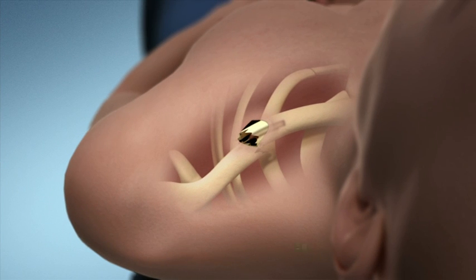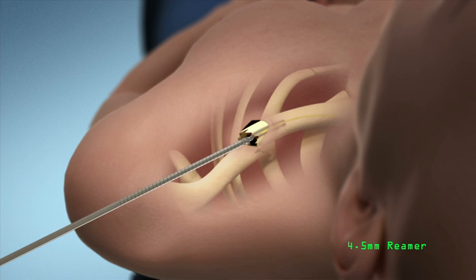Advance the spade tip guide wire until the 50 millimeter long gold section is completely past the most medial edge of the fracture. Note that the most medial edge of the fracture may be on the posterior surface of the medial segment. Use the 4.5 millimeter reamer on power to ream the canal to the tip of the wire. For certain fracture patterns, it may be preferred to use hand awls to prepare the medial fragment to the required 50 millimeter depth.